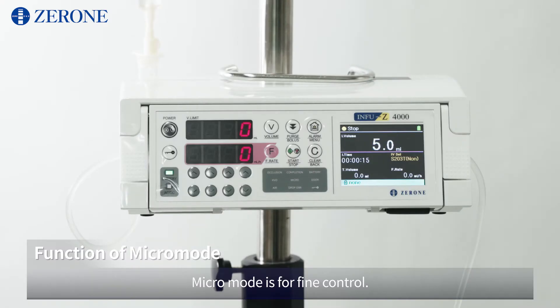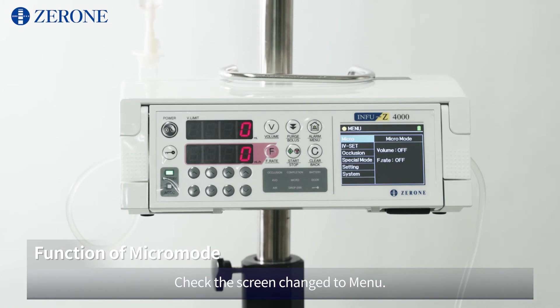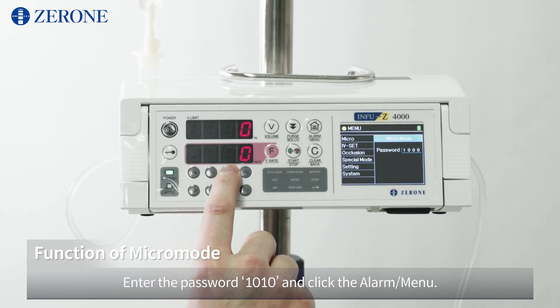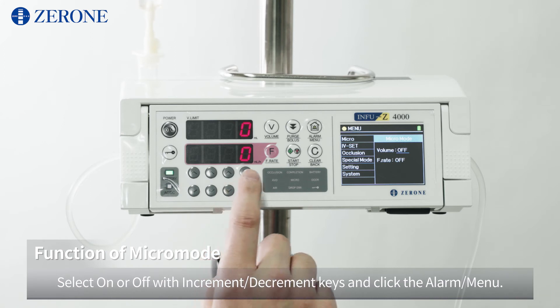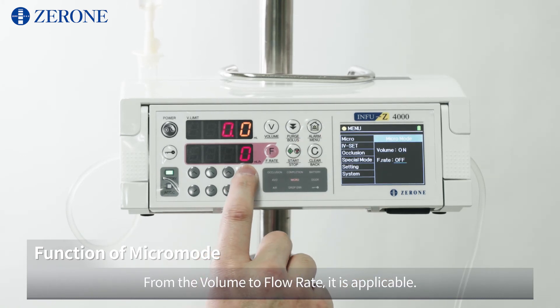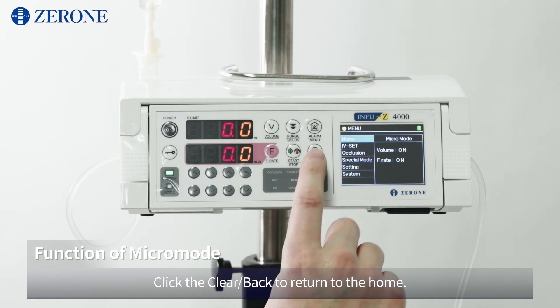Micro mode is for fine control. At the status of stop, click the alarm/menu for about 2 seconds. Check the screen has changed to menu. Check the micro mode at the first line and click the alarm/menu again. Enter the password 1010 and click the alarm/menu. Select on or off with increment/decrement keys and click the alarm/menu. From the volume to flow rate, it is applicable. Click clear/back to return to home.